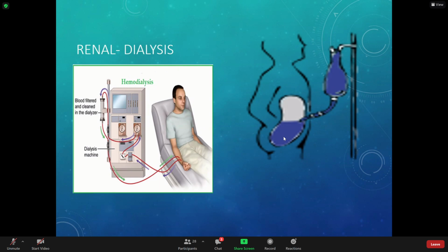So that's just a picture of somebody hooked to a dialysis machine. Again, this is taken 3 days a week. If you're taking care of dialysis patients, you realize that before they go, many times they have a lot of extra volume. We weigh them every day. And when do we get their weight? Typically before they go in the morning for dialysis. Most of them go early in the morning. Sometimes it's afternoon, but majority of patients, we try to schedule as early as possible in the day.